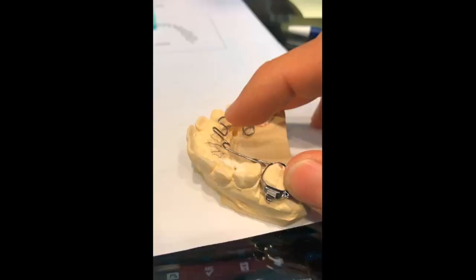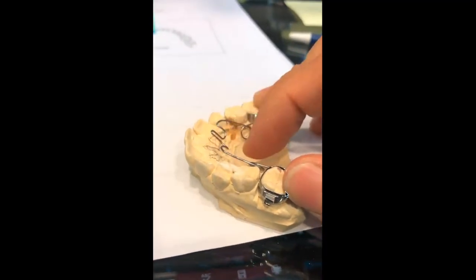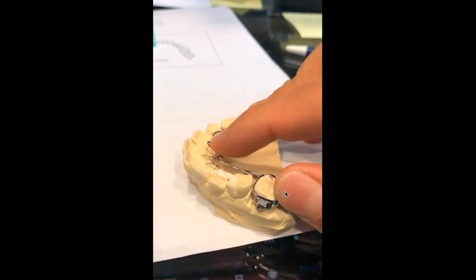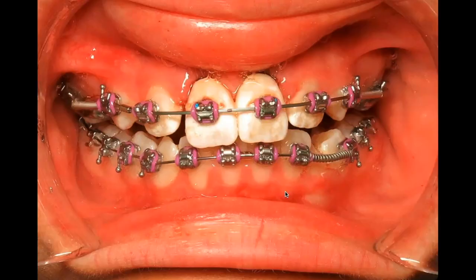The orthodontic part of the treatment was not nearly as exciting. Not near as exciting as exposing canines. Here's our activating mechanics. Not active, active, not active. All right, so we're utilizing some posterior anchorage. And that's what that looked like. So we're basically pull, pull, pull. And we have her centrals back in as her pontics. This is what that looked like.